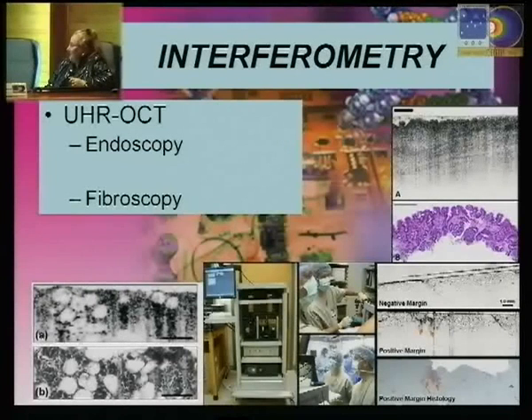What is nice from that is that you can obtain information without needing to have real physical biopsies.